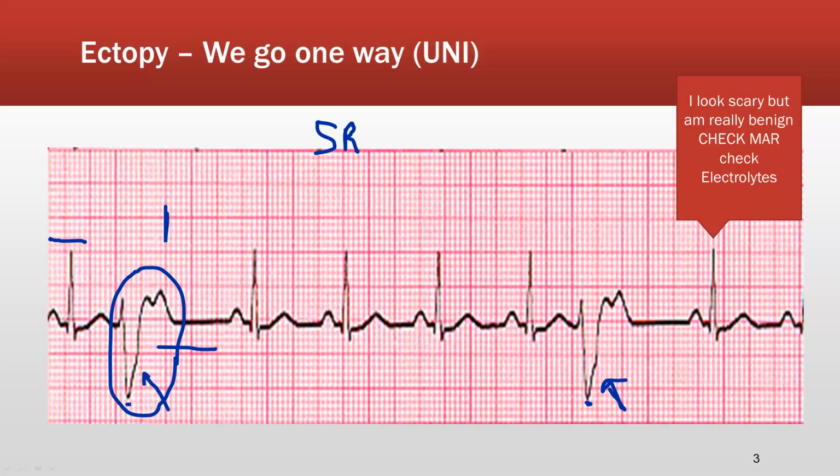So, sinus rhythm with, and now here's where you can be high speed or not high speed. It's not going to matter for basic nursing. But these are unifocal PVCs. So you can say unifocal PVCs. You can just say with PVCs. You don't even have to say with rare or with occasional. You're just telling us that this is what we are looking at for this 6-second piece of time.